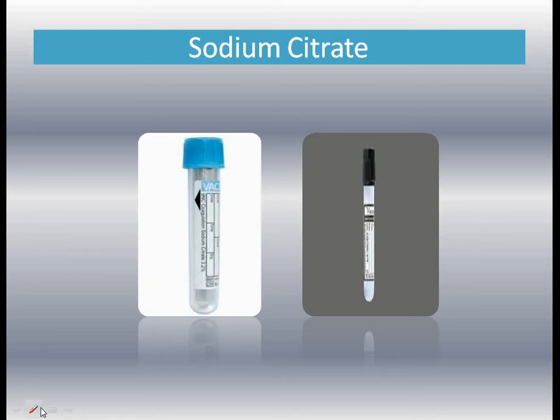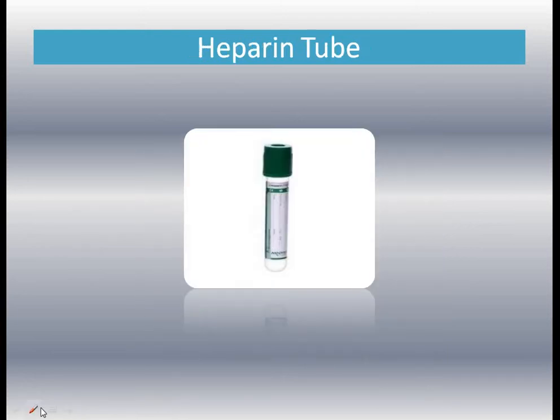5. Heparin is an anticoagulant which is normally present in our human system. In this tube the same anticoagulant is used. This tube is commonly used instead of the red clot tube. Unlike the clot activator, this tube gives plasma instead of serum. Many tests are common for the clot activator and heparin tubes.